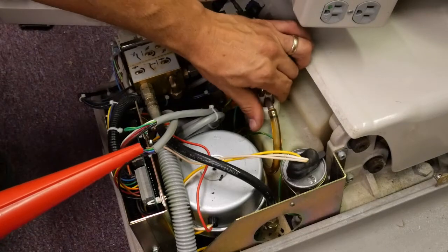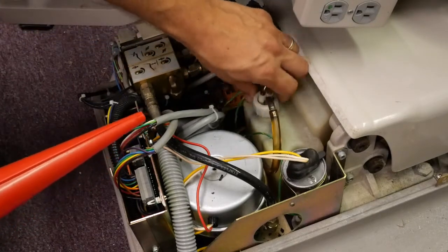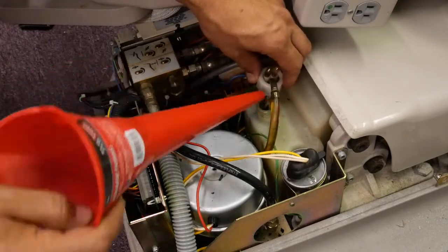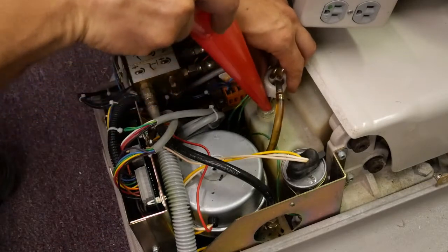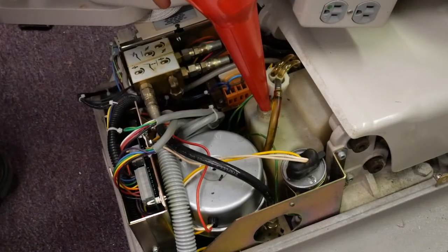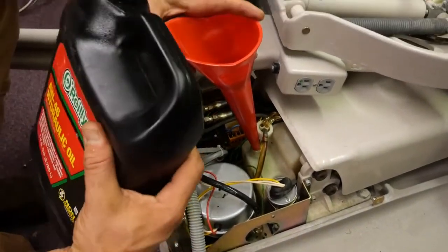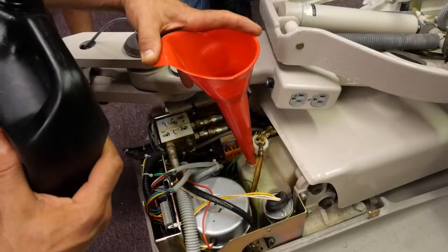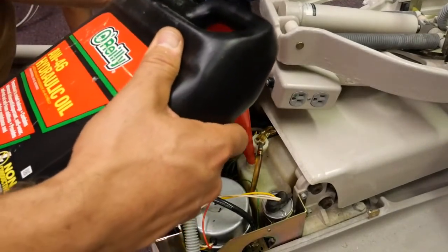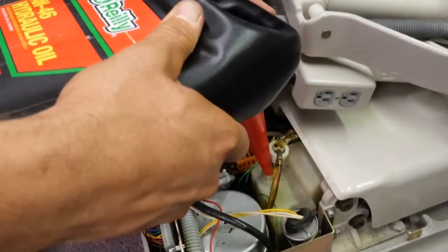What you do is there's a ring at the top, and you go ahead and release the ring, and this should allow for just a little bit of room for you to put in a funnel. And this will keep everything from getting super messy. And what you do is you take your AW46 hydraulic fluid or dental chair oil, whatever is prescribed, and you pour into the funnel, and you just keep an eye on the level.